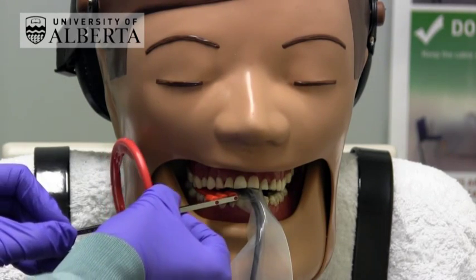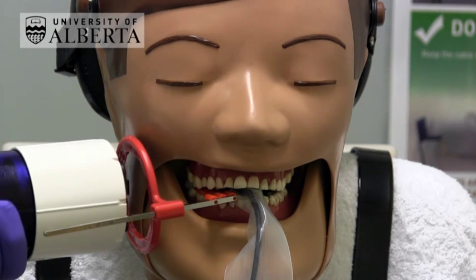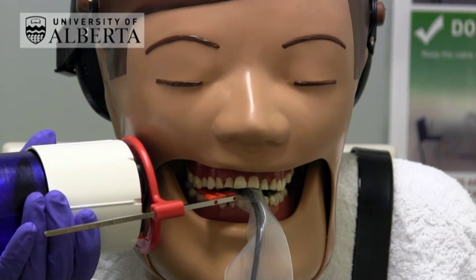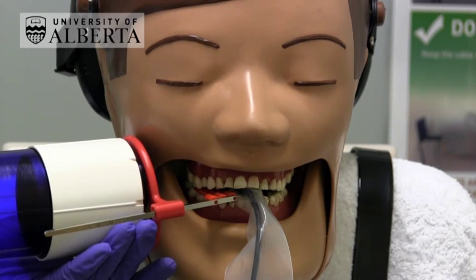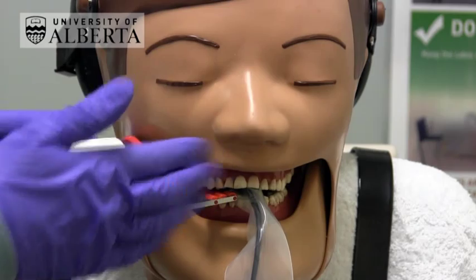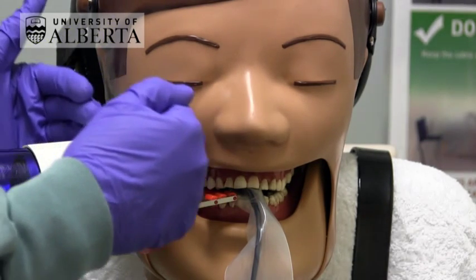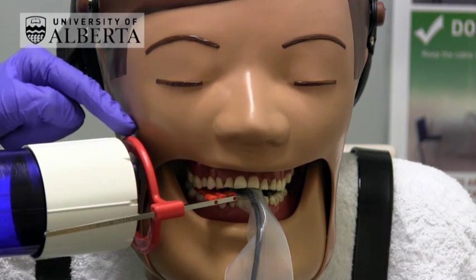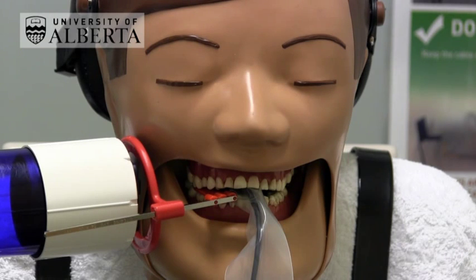Then position the aiming ring close to the cheek and align the tube head. Careful alignment with the collimator and the positioning ring is essential. Always check from the front, the side, and the back that the collimator is parallel with the ring and the notches on the ring align with the notches on the collimator. This is very important to avoid cone cutting.